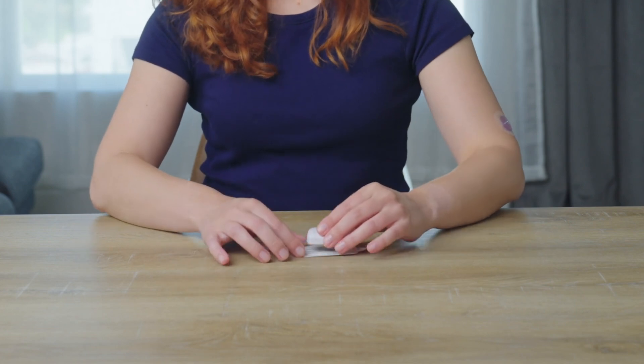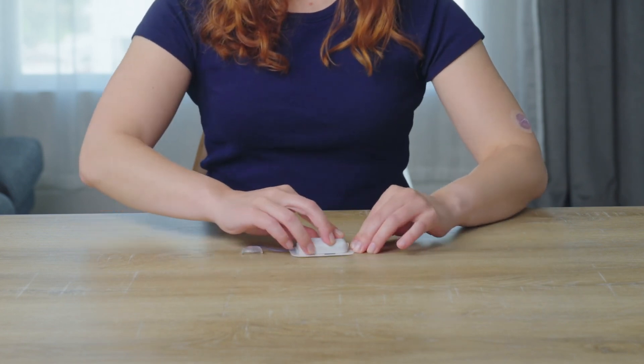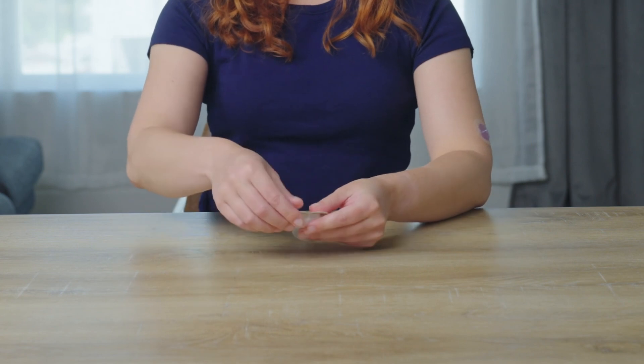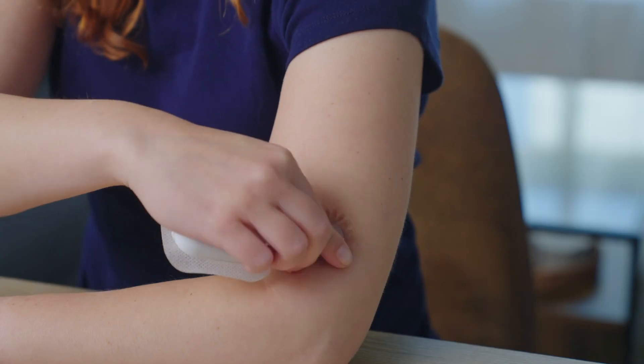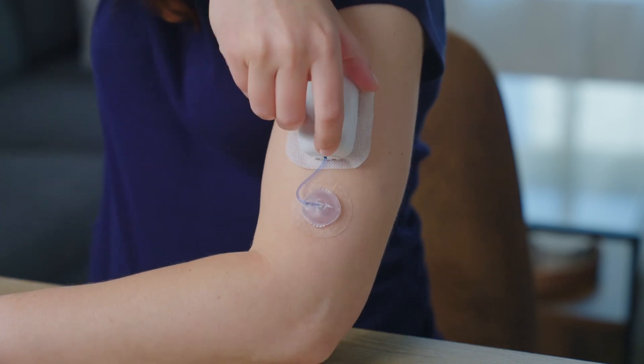Once the priming process is complete, the pump can be attached to the adhesive plate. The pump may now be attached by snapping the cap onto the infusion set and applying the pump adhesive in the surrounding area.